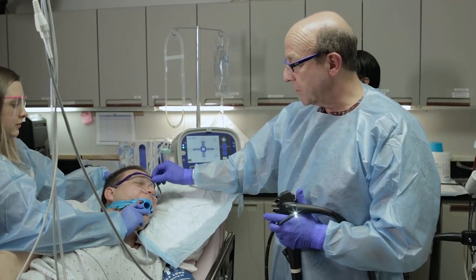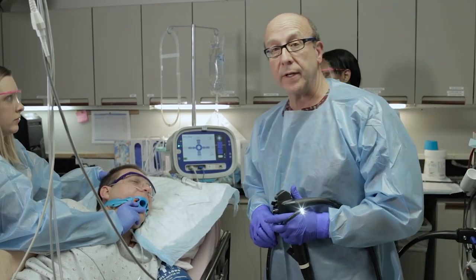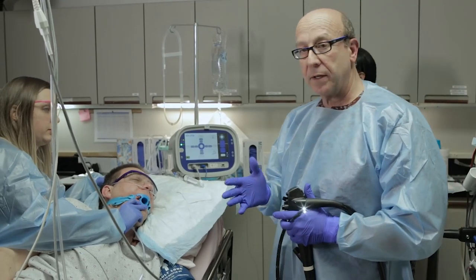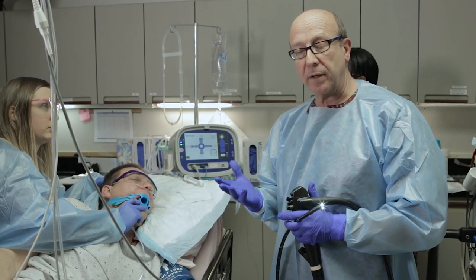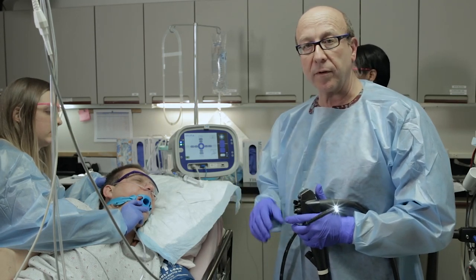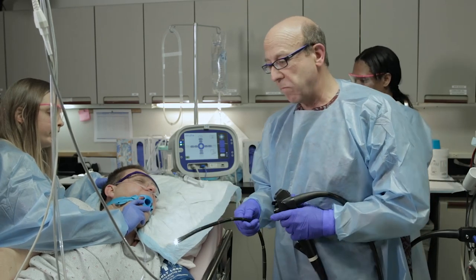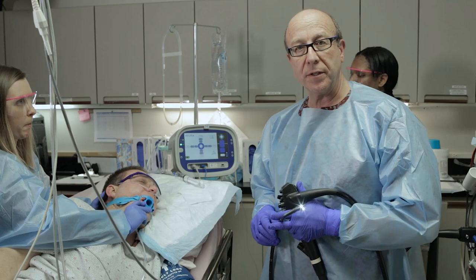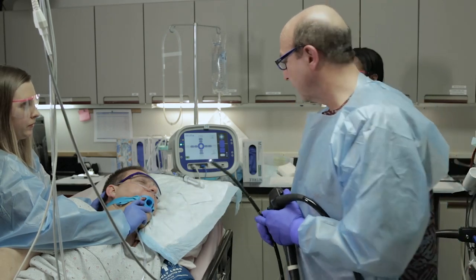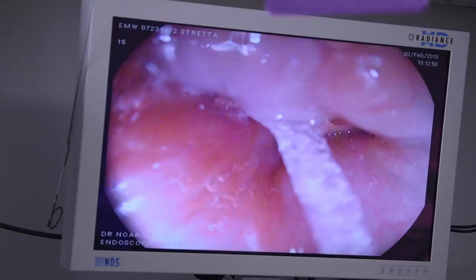We provide the patient with some eye protection in case anything were to come out of the endoscope. The first part of the procedure is an endoscopy so we can inspect the damage done by reflux, document that, and also establish the length of the esophagus, which is very important in order to measure what we're doing during the procedure. It is also normal to have oxygen on the patient as a safety measure. We're going to pass over the tongue.